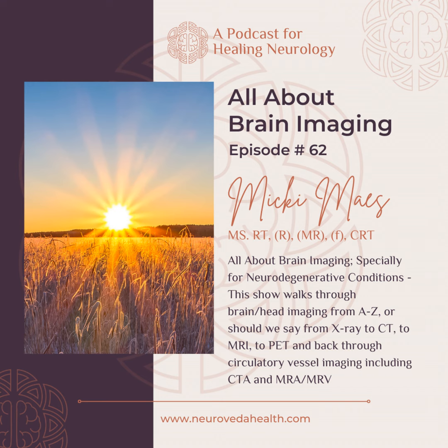So in these situations, we're looking for that radio tracer uptake or the speed of the uptake, whether it's slow or whether it's fast, depending on the type of scan and what we're looking at, the type of report. So you can find out a lot about the metabolic processes of the brain and, of course, the entire body using PET scans. So it's just another level of information. But also keep in mind, PET takes a long time and is pretty costly, and it just isn't available as much as CT and MRI.